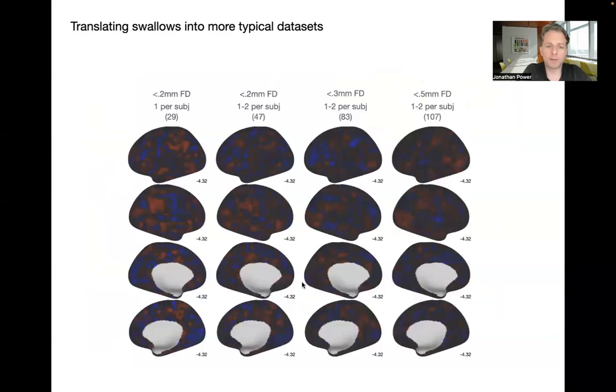One interesting thing that Lisa, who was working on this, did is that she wondered, in the past we'd used isolated motion as something to look at the bold signal of. So like the neural correlates of having moved, sensing movement or producing motion of the head. And that gave us an activation profile that was essentially the orange network, which I'm showing you here again in swallows is what's activated.